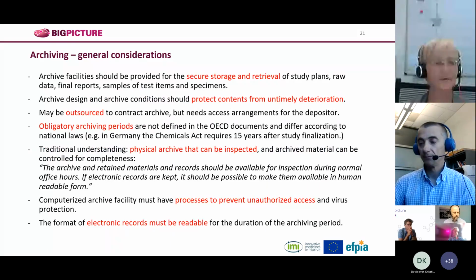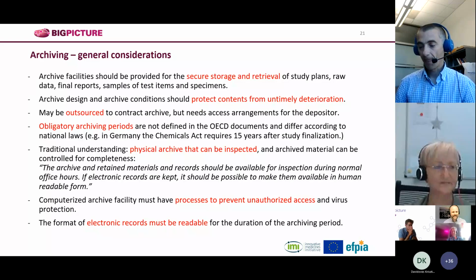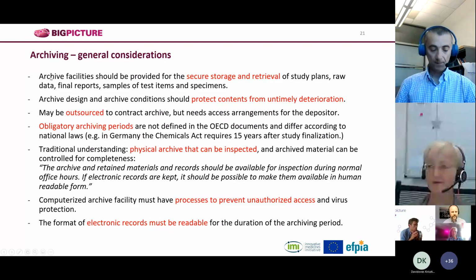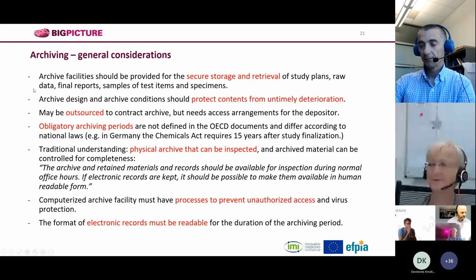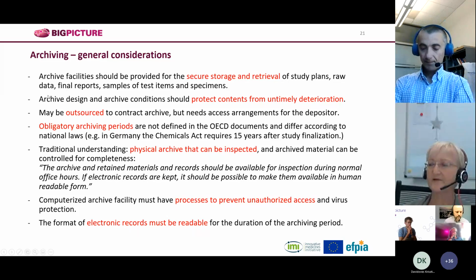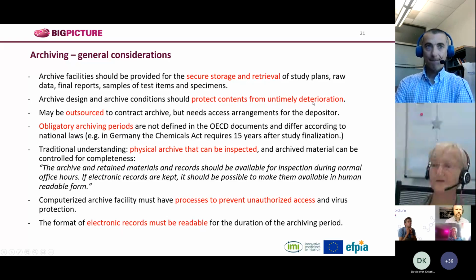Yes, now we're coming to archiving. So archiving of materials associated with non-clinical safety studies. What is said in the guidelines traditionally? Archive facilities should be provided for a secure storage and retrieval of study plans, raw data, final reports, samples of test items, and specimens. The archive conditions must protect contents from untimely deterioration.